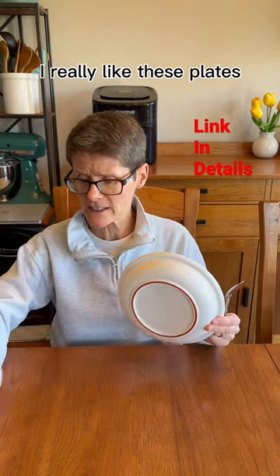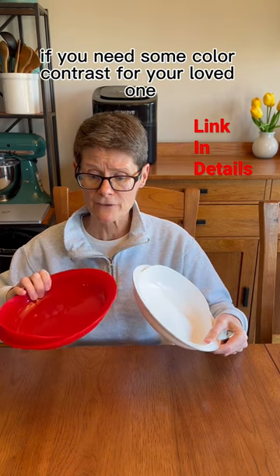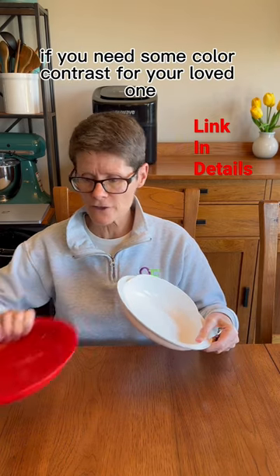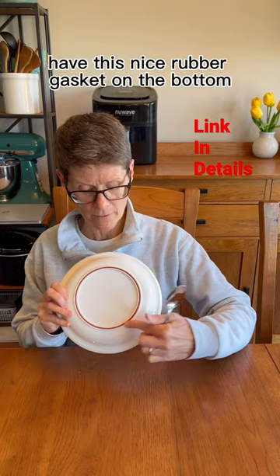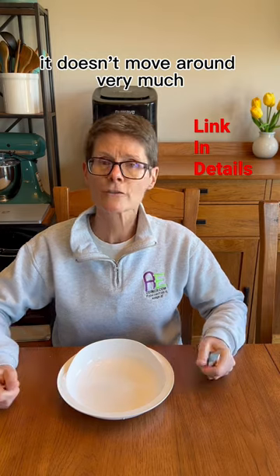I really like these plates. They came in a set of two, a white one and a red one, depending on if you need some color contrast for your loved one. And they also on the bottom have this nice rubber gasket, so when you place it on the table, it doesn't move around very much.